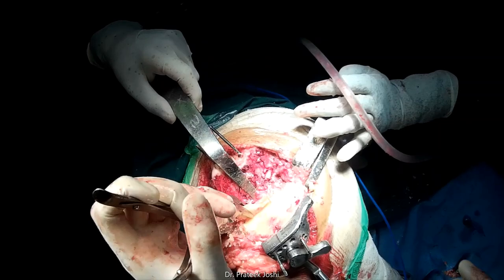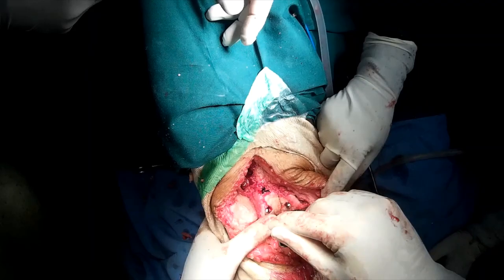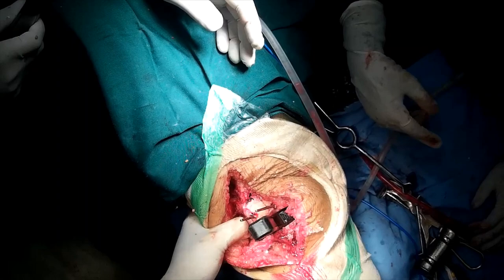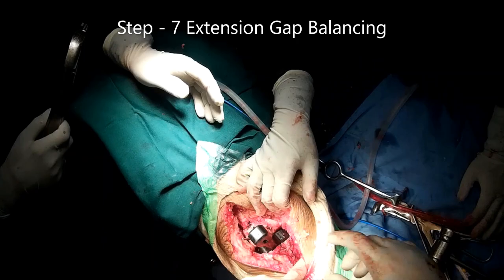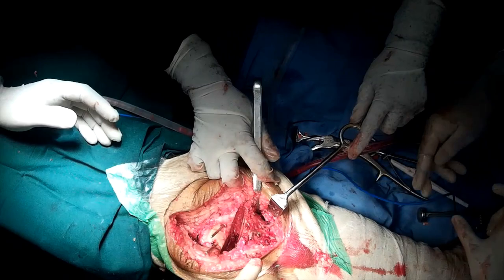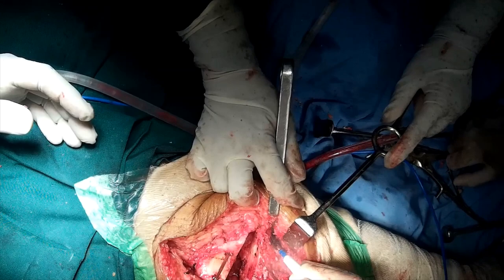Extension gap should be rectangular and there should not be any opening on medial or lateral aspect. In this case, there was slight tightness over the medial aspect, so we did further medial soft tissue release.